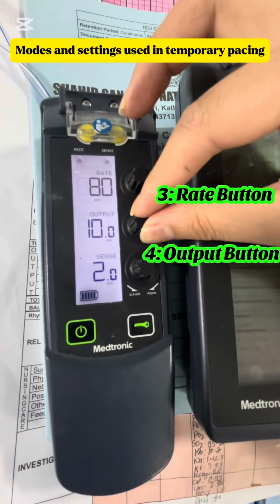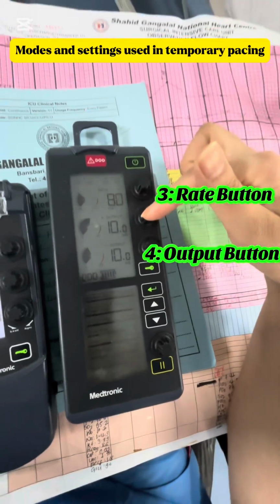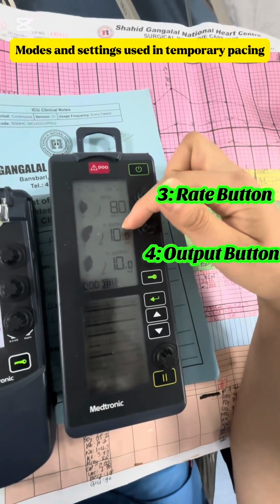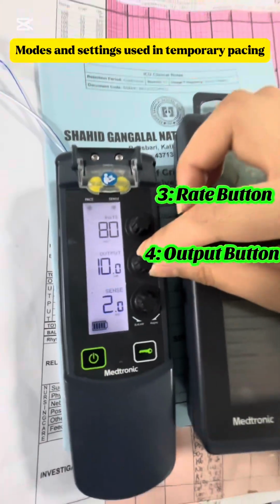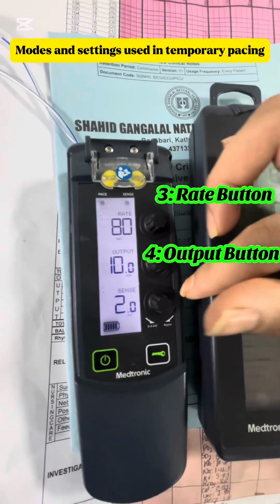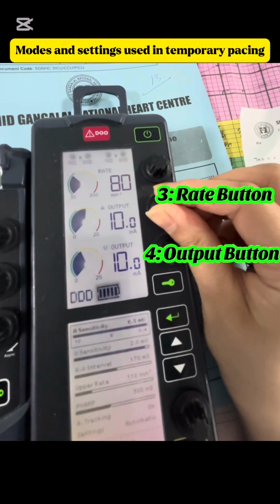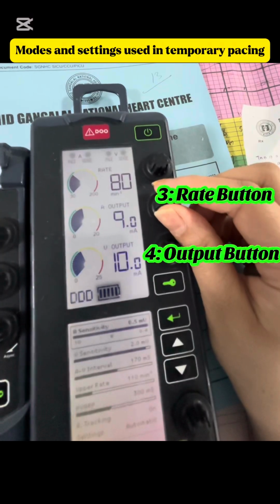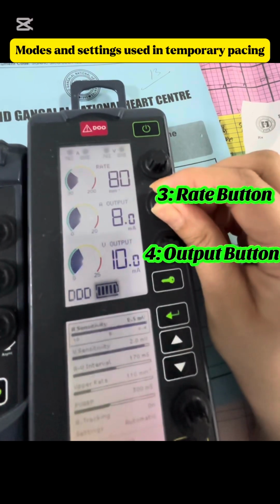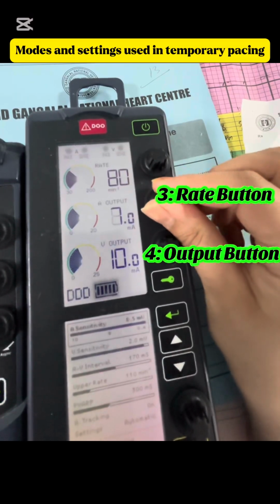And this is the output button. In a dual chamber pacing box, there are two output buttons, one for the atrium and one for the ventricle. But in a single chamber pacing box, there is only one output button. Usually, the patient's output is decided after testing the pacing threshold. Threshold is set by gradually reducing the output till the pacing capture is lost, and then quickly raising it back.